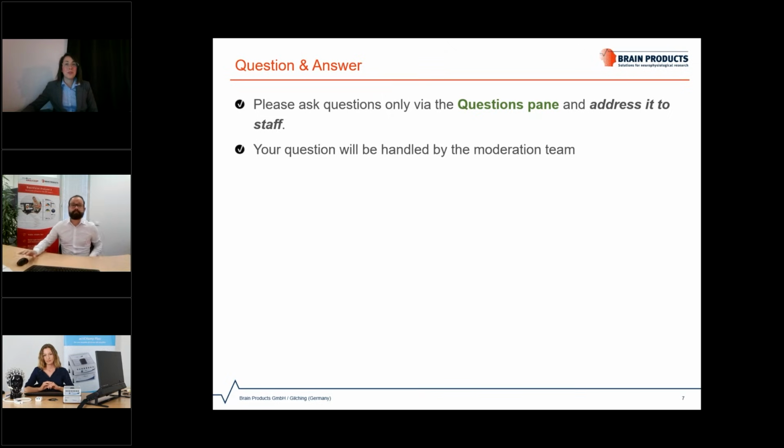Michael, I have a question for you. How would a pipeline for fixation-related potentials be different? This is one of the things that Laura already mentioned in the beginning, what people with eye trackers and EEG would maybe do. It can, of course, be very different because it can be much more complex with the paradigm.